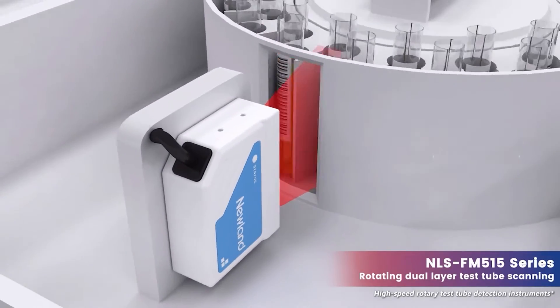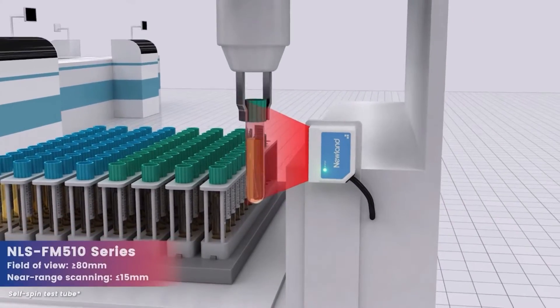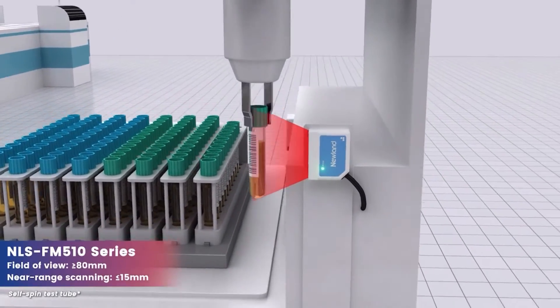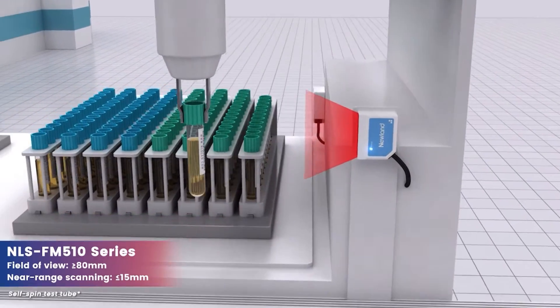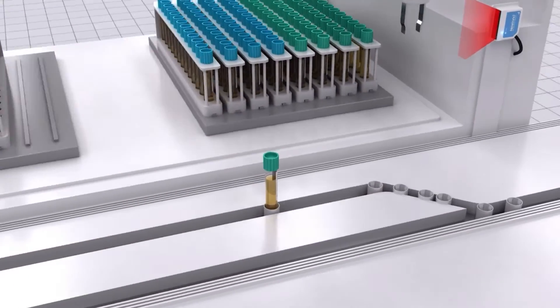Equipped with a wide field of view, the FM510 series was engineered for decoding high-speed moving barcodes on test tubes at short distances.